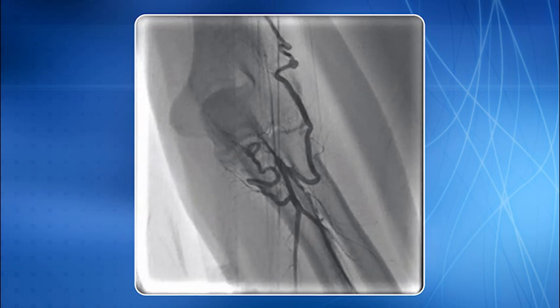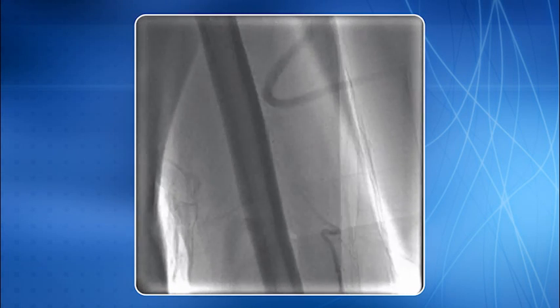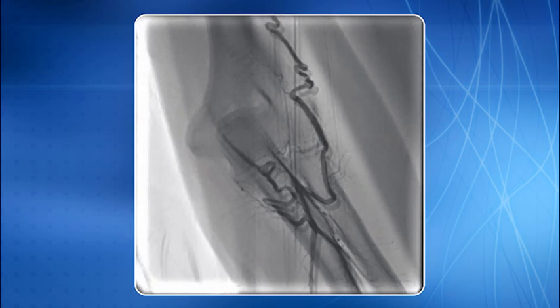In this situation, at times you are able to palpate the radial artery pulse so well, your wire also goes up to an extent, but it does not go beyond a particular point, and when you inject through cannula, you will find this sort of situation. This is actually very rare, but it is a very important situation which is to be kept in the mind.